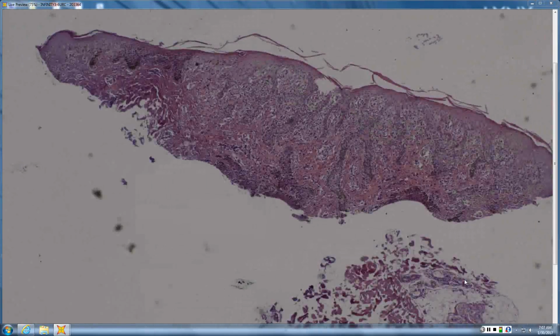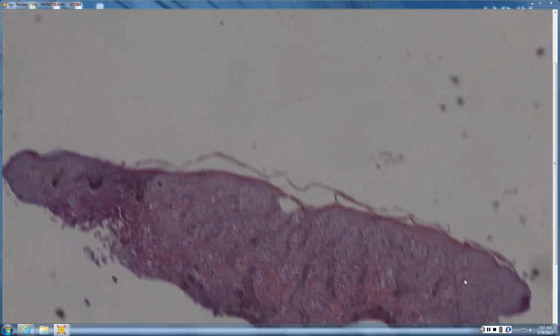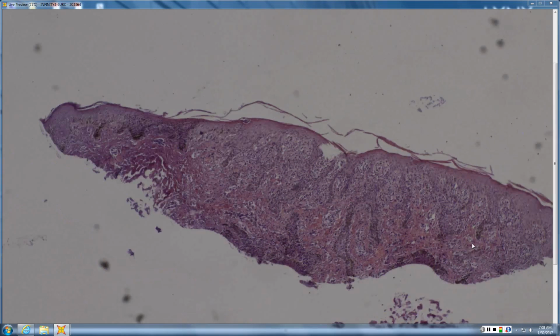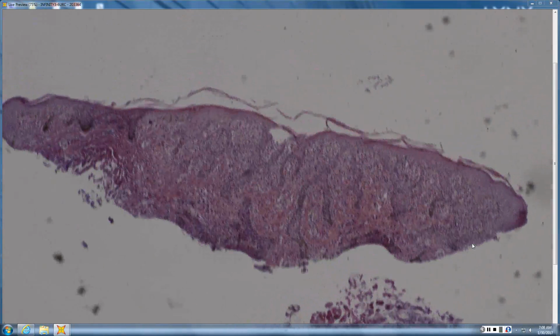So this one is your classic case of syphilis, and I wish all of them looked like this, because when you look at it, it can't really be much else. And one of the biggest clues is that anytime you see two predominant patterns in the same specimen, that really should make you at least think a little bit of syphilis, and ever more so when it is interface combined with psoriasiform. So that's what you have here.